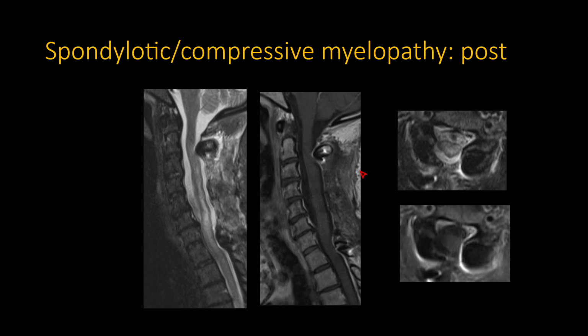And in particular, in this case, if you had said things like a tumor or something, they wouldn't go and decompress the patient, for instance. They might want to try to biopsy the cord or something. But if you include compressive myelopathy and they do their decompression and it looks like there's nothing untoward, they might just not biopsy the cord and go ahead and just finish with their decompressive surgery.